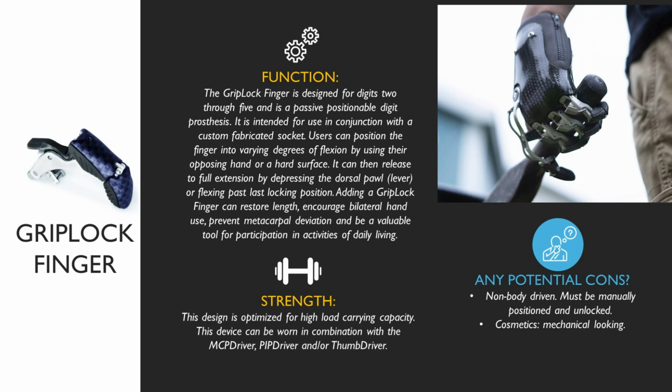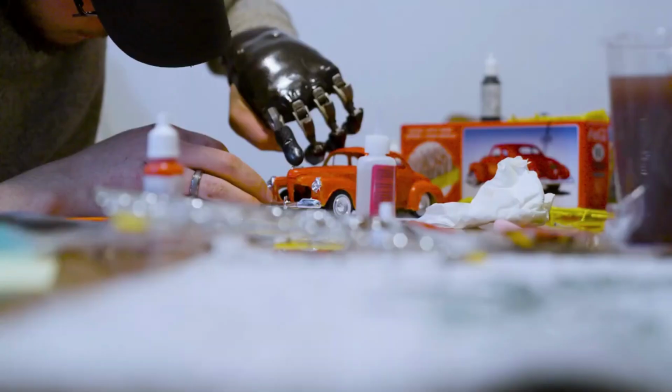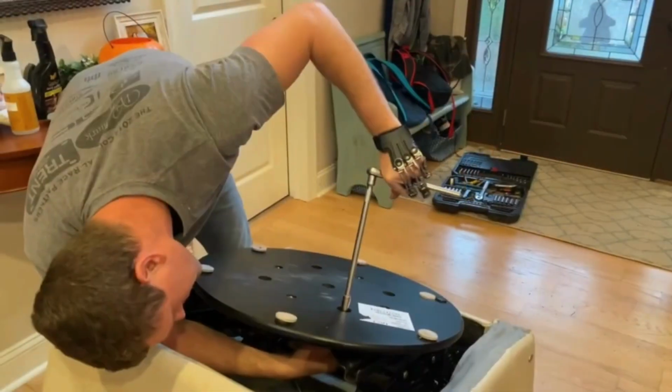All right. Perez, anything on these guys while I play this video? In that last picture, that patient was wearing an MCP driver as well as the grip lock fingers. And I've seen, again, at the eval where we're kind of basing this off of the patient's activities and what they're wanting to do at work or everyday life, you know, we mix and match these devices together. And I'd say that's a little bit of a difference versus a PIP and an MCP driver together because of the way that they function and how some are voluntary or body driven versus these ones are kind of manually positioned, which is what he's showing you here. He's got that exact scenario.